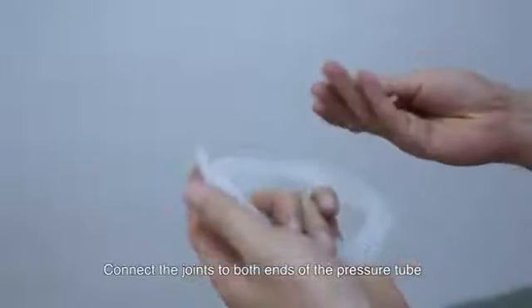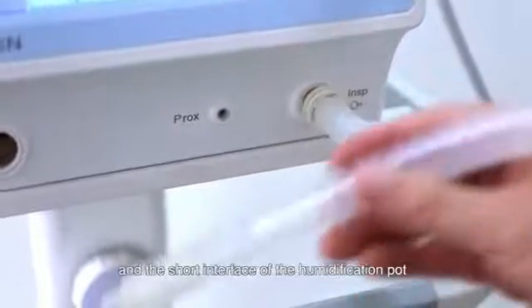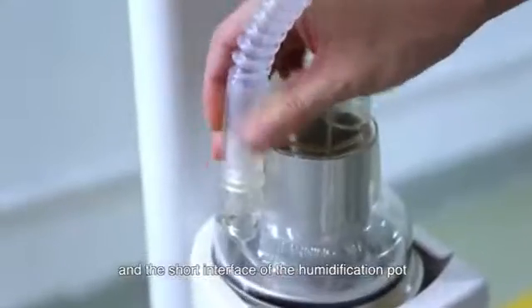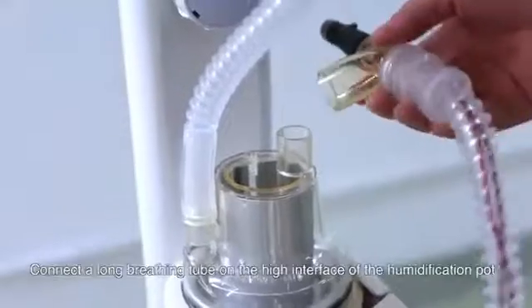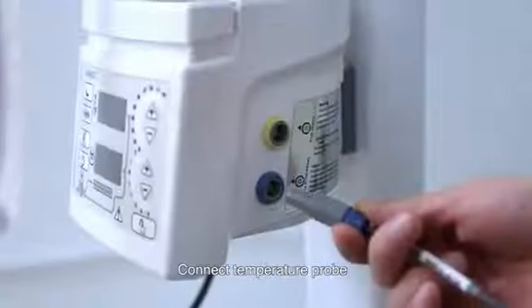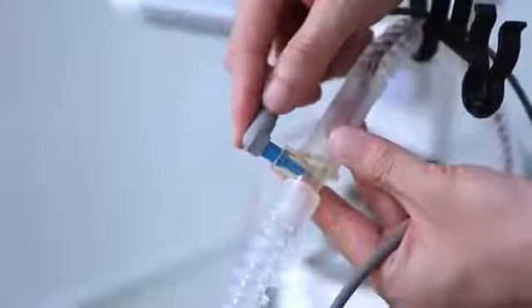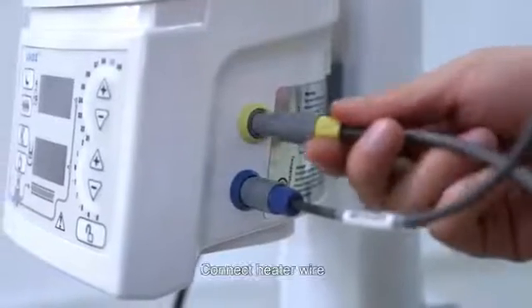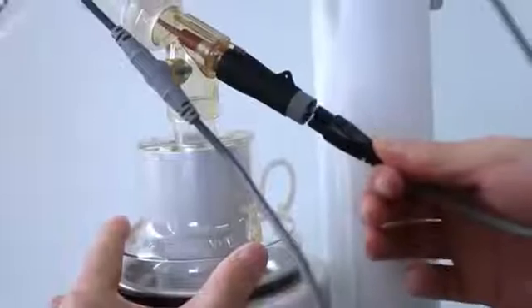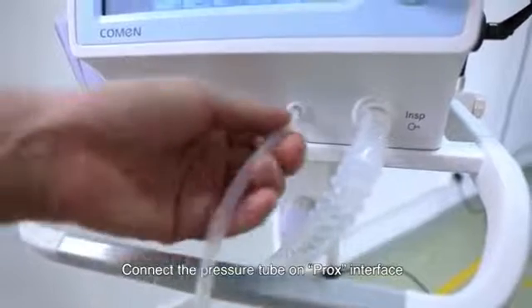Connect the joints to both ends of the pressure tube. Use a short tube to connect the INSP interface and the short interface of the humidification pot. Connect a long breathing tube on the high interface of the humidification pot. Connect the temperature probe. Connect the heater wire. Connect the pressure tube on the prox interface.